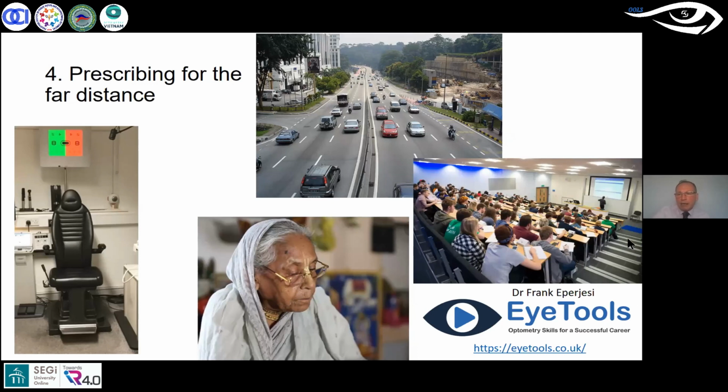Again, if you're a student, many of you are, and you're sat in the lecture theatre, if you can get near the front, great. You might be at about 6 meters from what the person is showing you. But in fact, that looks like my old lecture theatre. I think it might well be. If you are sat at the back, then you need to see beyond 6 meters.